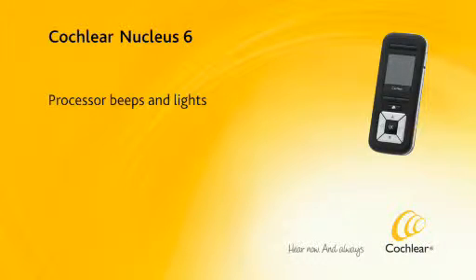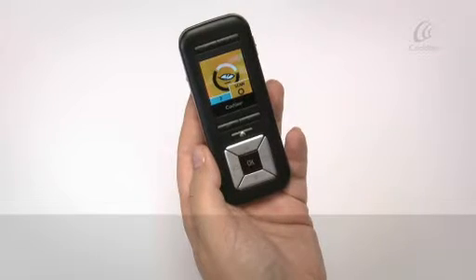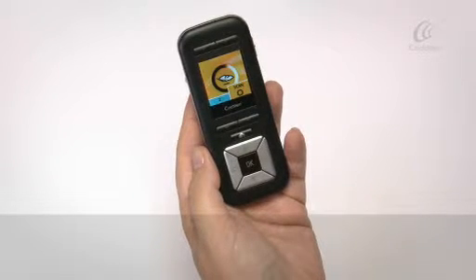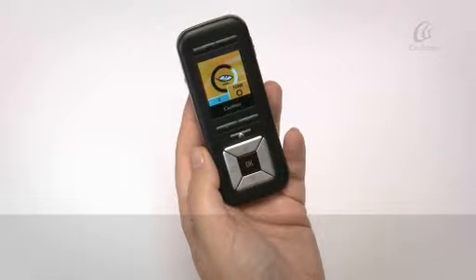Processor beeps and lights. Processor beeps can be turned off or on.